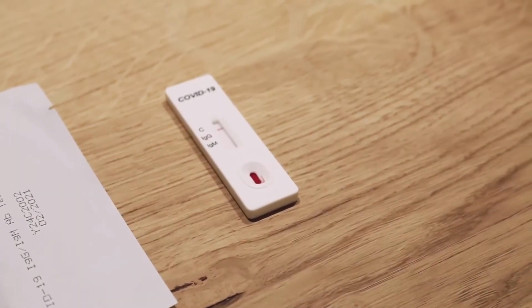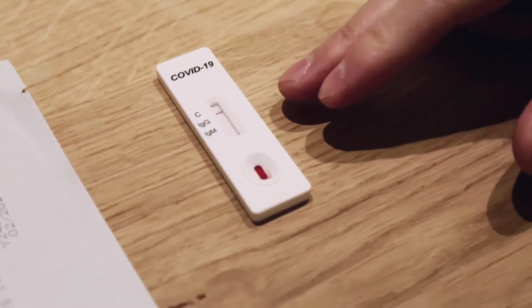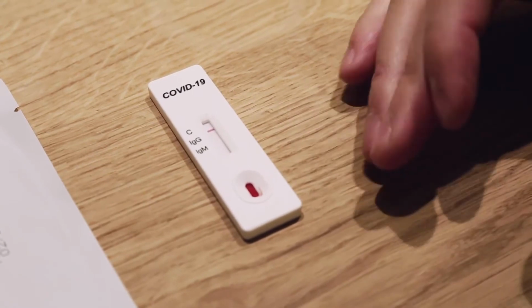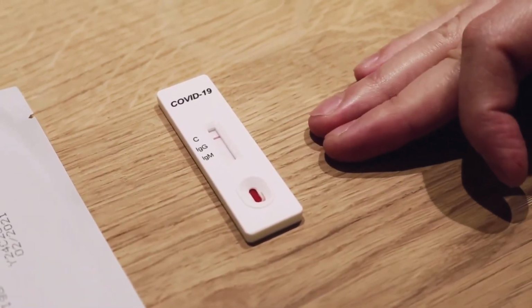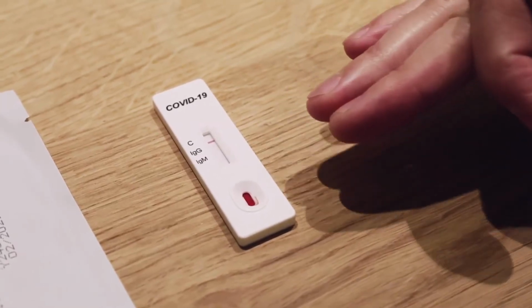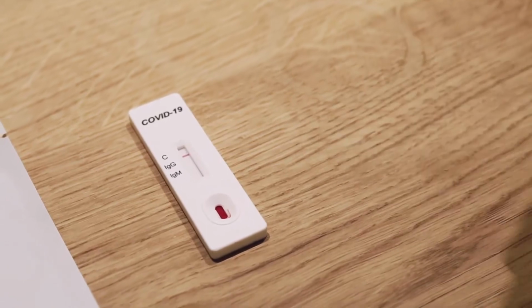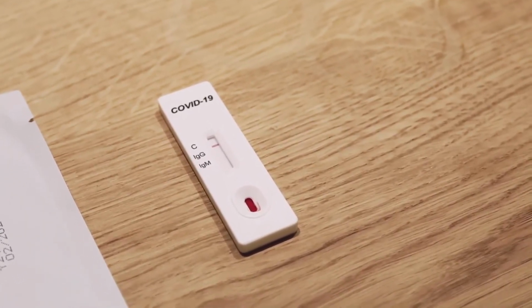Now 15 minutes have passed and you can see a control line on the test, meaning that the test has been developed completely, and there are no apparent lines for the IgG and IgM antibodies, which means that either I haven't had the virus or I haven't developed immunity against the virus.